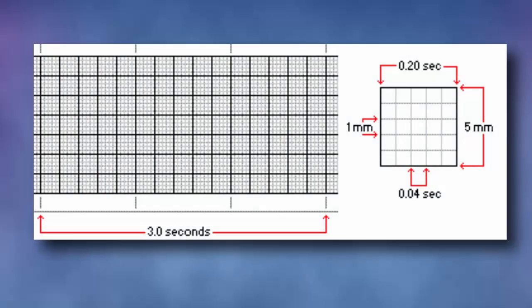This video is an introduction to EKGs to get you started with the basics. Some of you will be learning more about the analysis and interpretation of these things in the future. For now, we will stick to the introductory material. Before we look at the ECG tracing, it is important to understand exactly what you're looking at. So let's learn first about the graph that is used to do the analysis and take the measurements on the tracings.